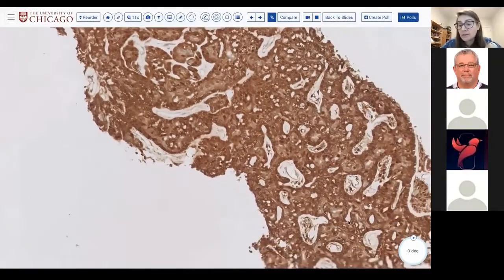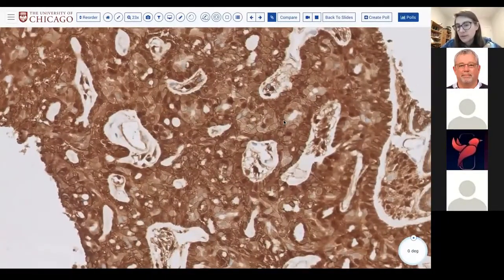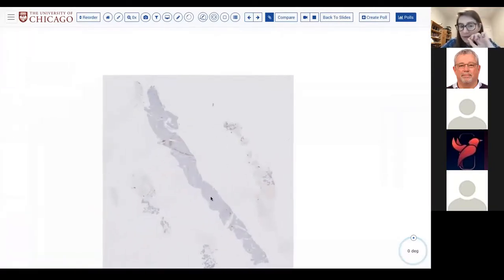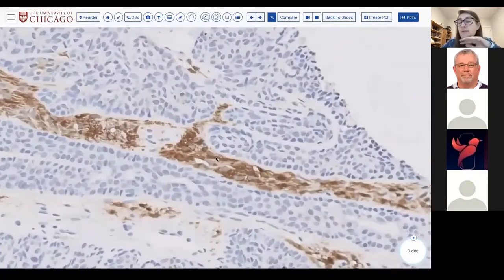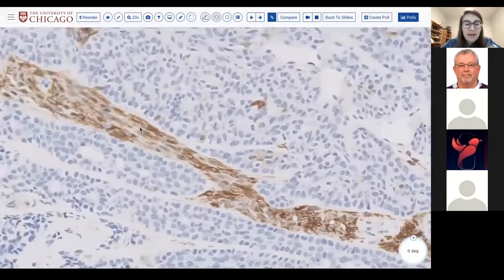So this is quite good for a basal cell neoplasm, most specifically a basal cell adenoma. So S100 in spindle cells of BCA, yeah, I think is quite good. And if you are careful about interpreting the location of the S100 positivity, you will see that it very, very strongly highlights that spindled stroma, as you can see here.